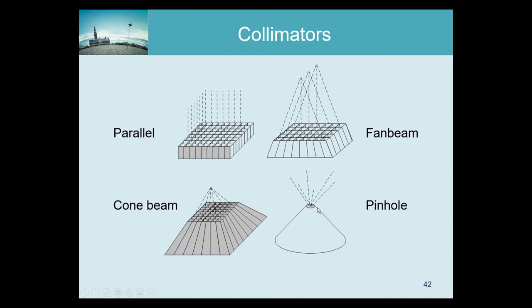Pinhole is also used to do some planar imaging in thyroid for the same reason. The thyroid is relatively small, and so you get a thyroid image which is magnified, so you get better resolution, and you do that with reasonable sensitivity. But again, that image is severely deformed, so it's hard to interpret.